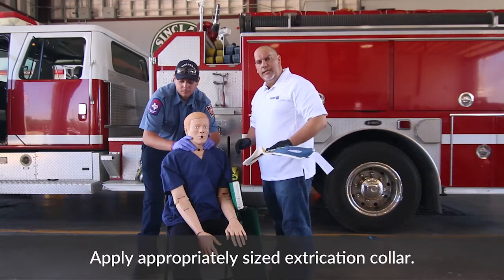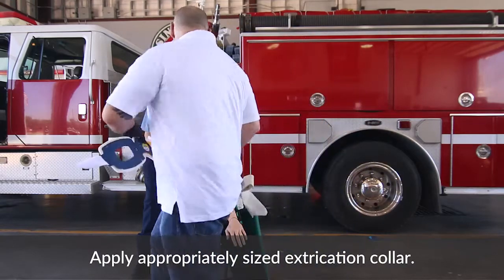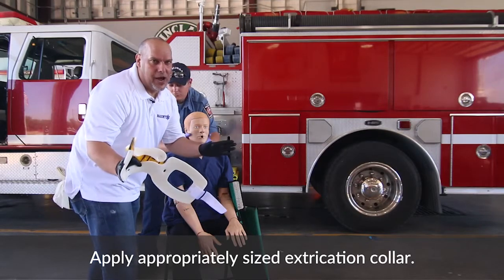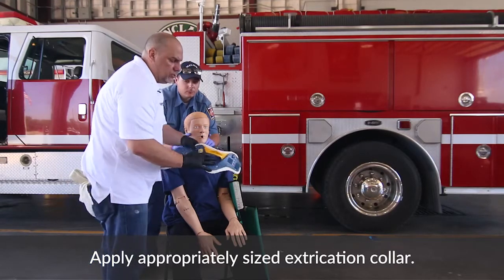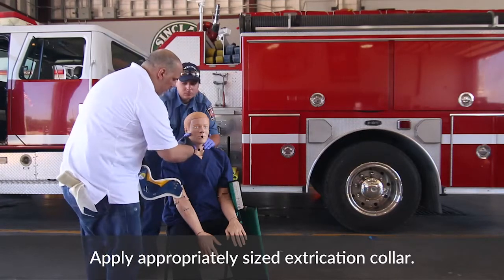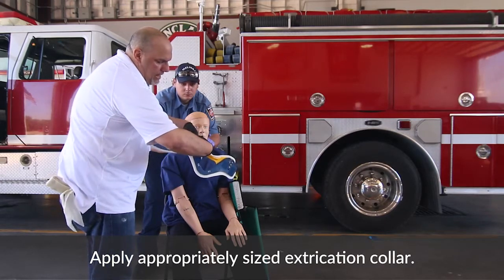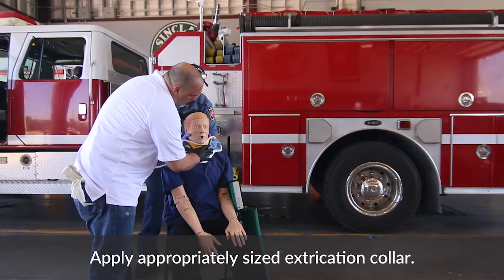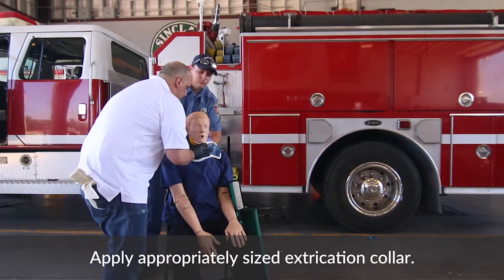Our partner is doing a great job of holding manual inline stabilization. What we want to do now is set the collar. When setting the collar, make sure it's going to be as comfortable as possible — and let me tell you, this isn't a comfortable process, whether it's putting it on or the patient wearing it. Make sure that you measure it the right way. How do you measure a good cervical collar? It's from the shoulders with your fingers to the bottom of the ear — that tells you you have the right size. Now go ahead and put the collar on.